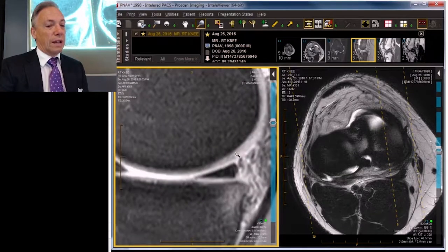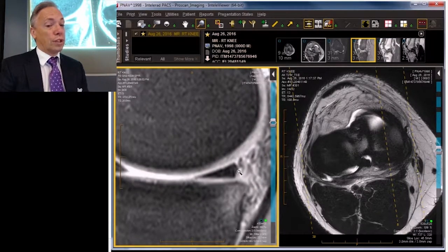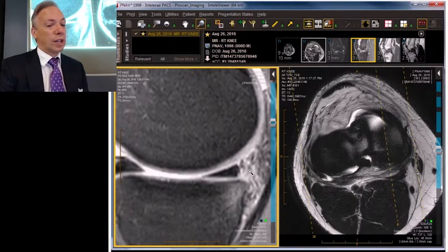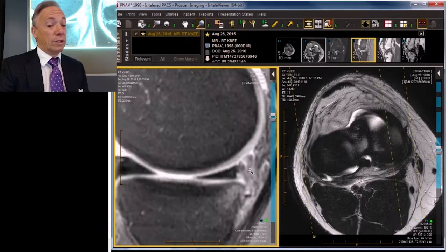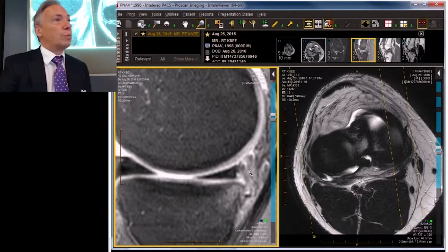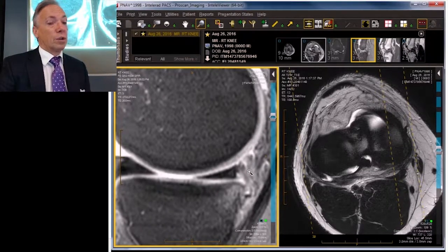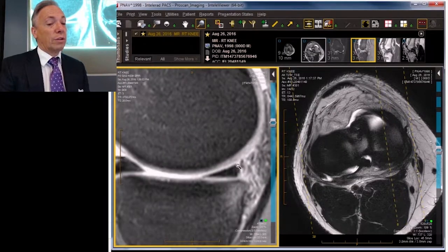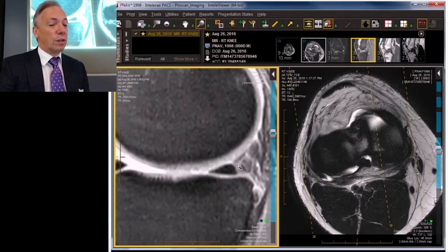The sliver tear is that thin, tiny little vertical tear that sits right adjacent to the capsule, and there it is. Once again, that signal will persist — it'll become much less swollen, much less hot, much less hyperintense over time — but it'll persist for many years if not forever. We don't want to call this a menisco-capsular separation, but it is a menisco-capsular junction sprain or injury or bleed.